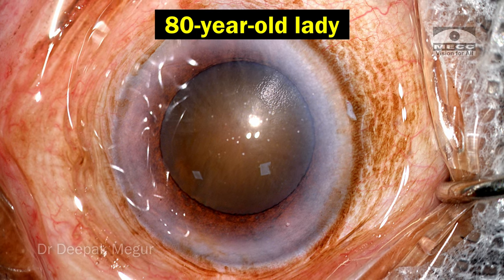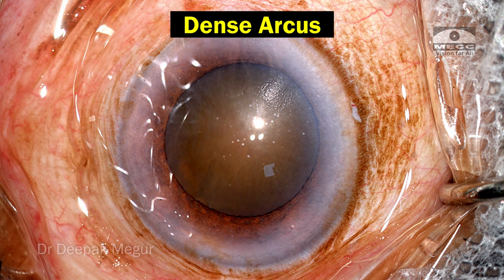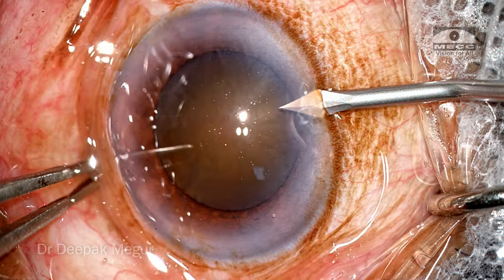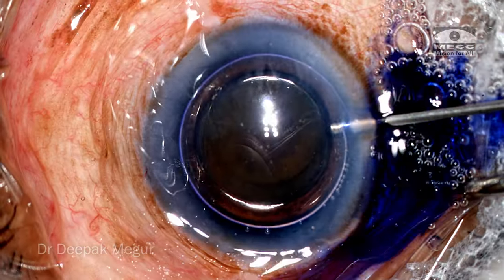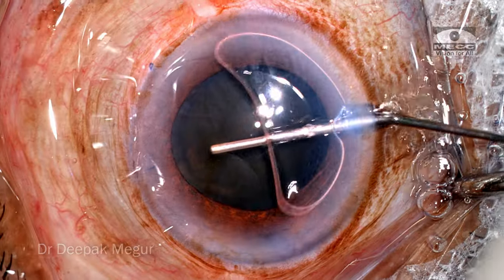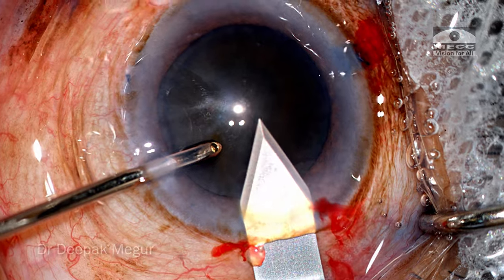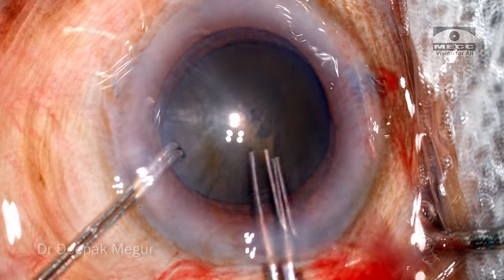She is an 80-year-old lady who has a dense brown cataract. Point to note here is the presence of a dense arcus, which is also relatively wider. I have observed that in these patients, some of the attachment to Descemet's membrane with the stroma is not so great, and these eyes could be vulnerable for Descemet membrane detachment, especially in the incision areas. So one needs to be mindful of this.